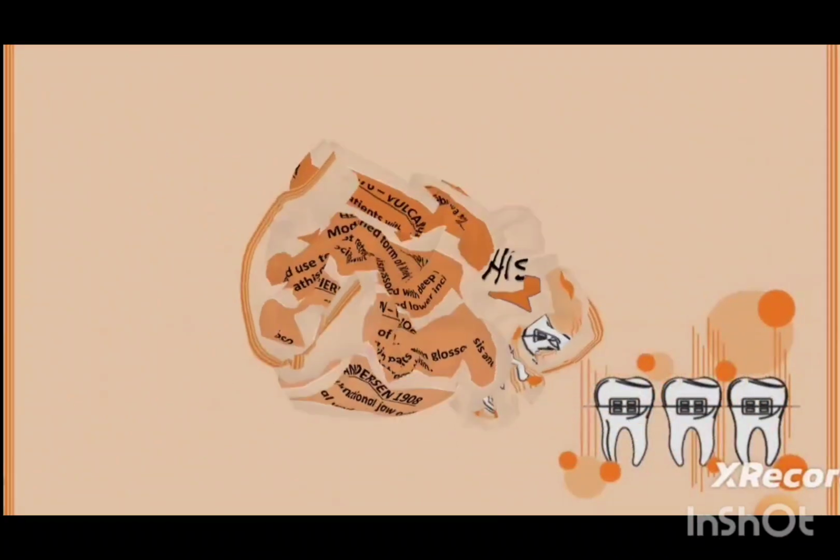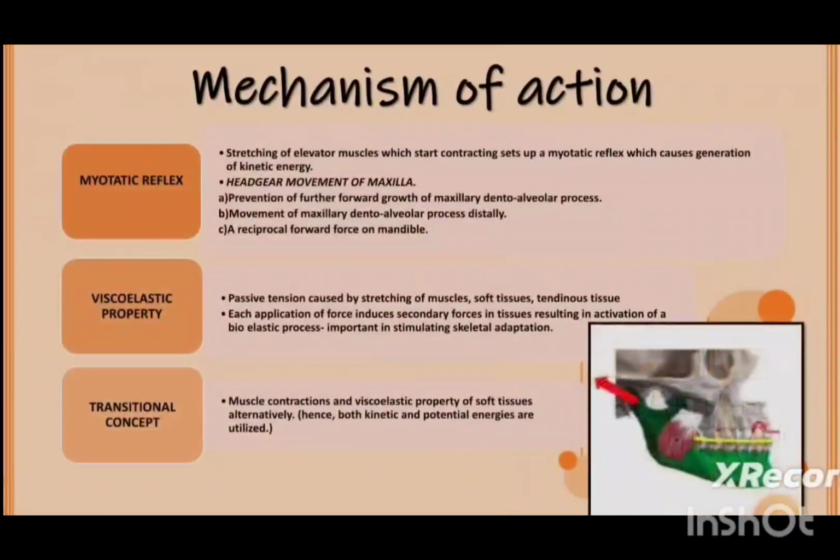Now let us talk about the mechanism of action of activator. There are three known basic concepts. The first one is myotatic reflex, second is the viscoelastic property, and the third one is the transitional concept. Talking about the myotatic reflex, since the patient moves his mandible forward to engage the appliance, this results in stretching of the elevator muscles of mastication, which start contracting and thereby set up a myotatic reflex. You can appreciate in the image the stretching or the activation of the muscles of mastication.